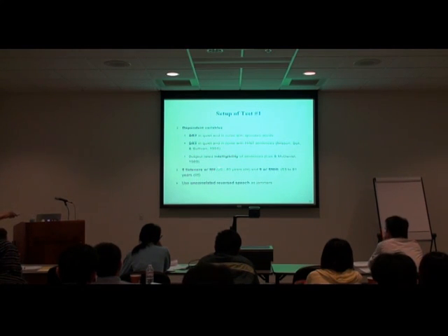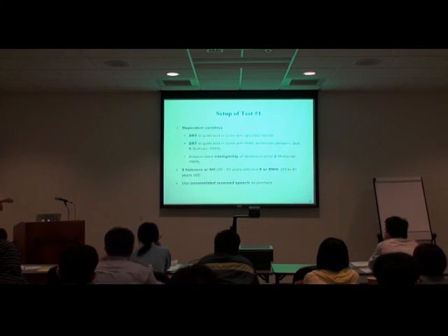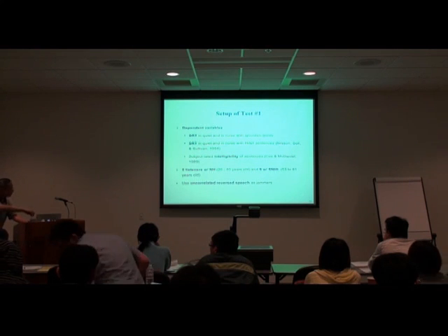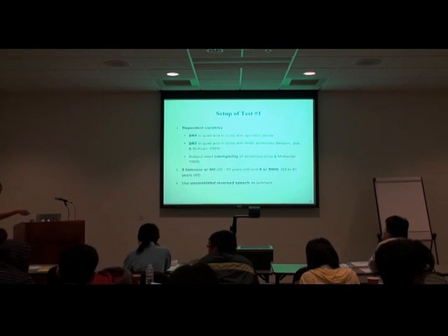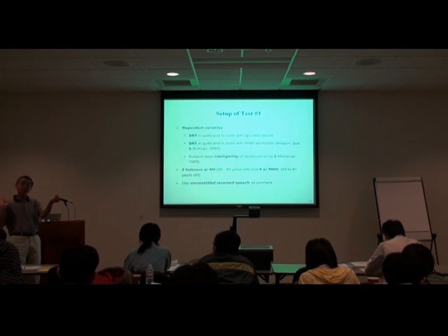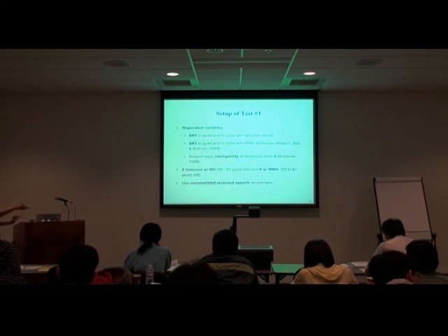We tested subjects with normal hearing and subjects with sensorineural hearing loss. And we're going to use different kinds of jammers. In the first condition, we're going to use reverse speech, meaning speech played back reversed in time, as a jammer because that's unintelligible, right?